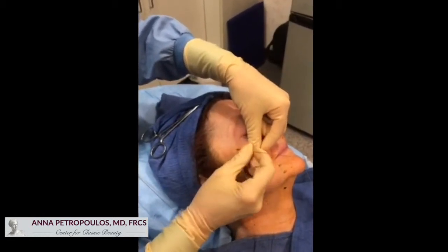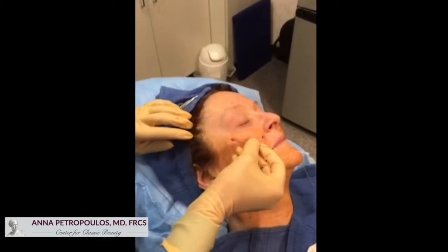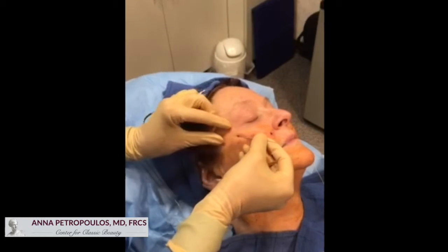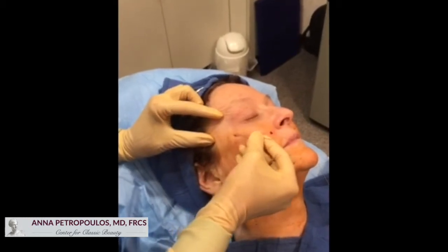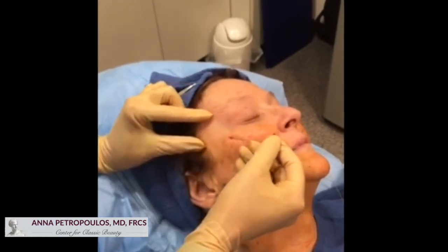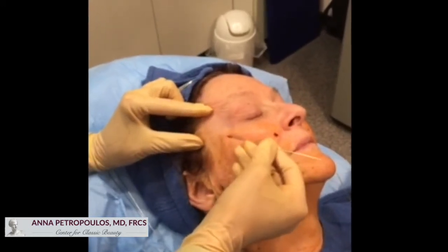We go in at right angles, tilt it, and then aim for our previously marked exit point while holding tension on the skin. If we are in the right plane, the patient should not feel any discomfort.